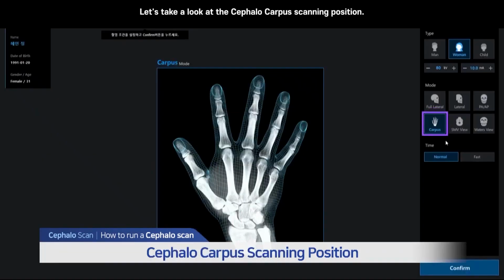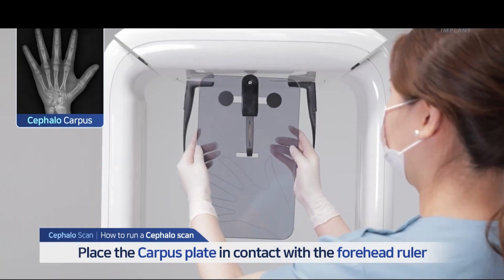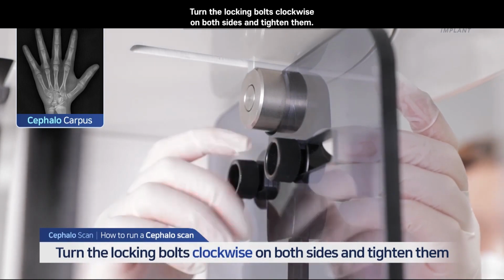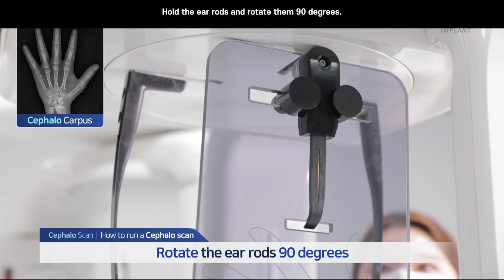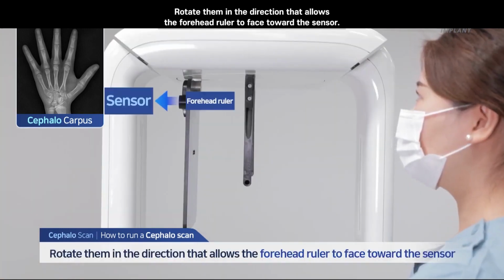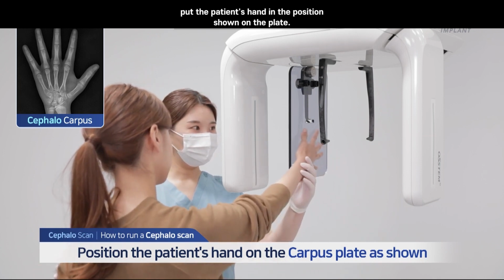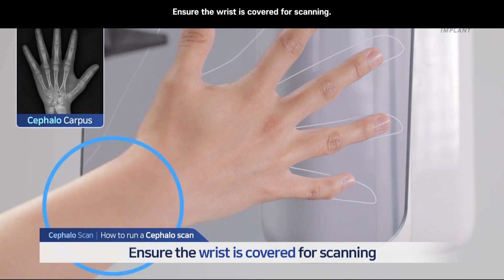Let's take a look at the cephalocarpus scanning position. Place the carpus plate in contact with the forehead ruler. Turn the locking bolts clockwise on both sides and tighten them. Hold the ear rods and rotate them 90 degrees. Rotate them in the direction that allows the forehead ruler to face toward the sensor. When the carpus plate has been placed, put the patient's hand in the position shown on the plate. Ensure the wrist is covered for scanning.